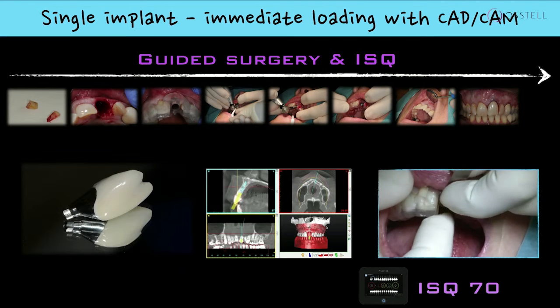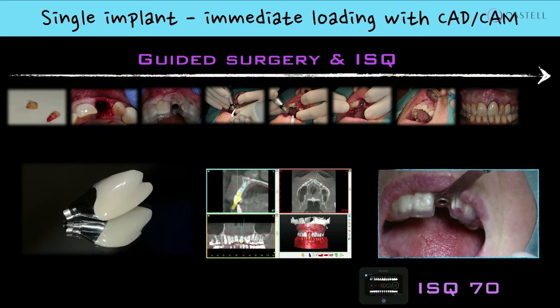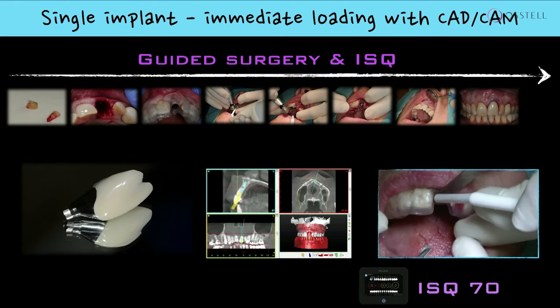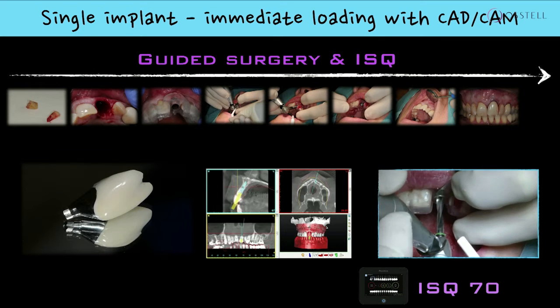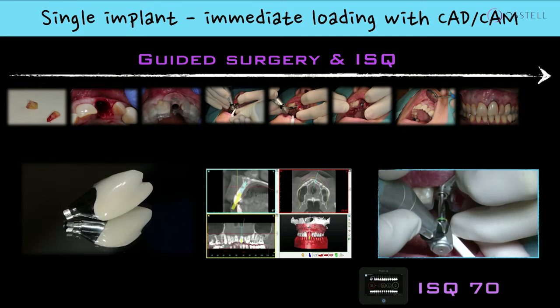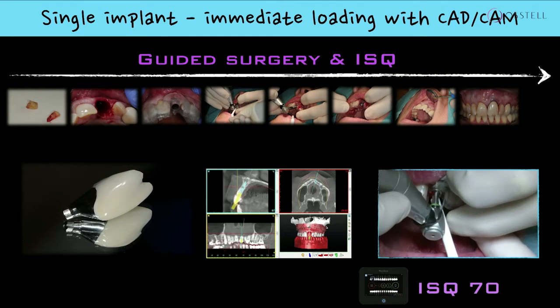So of course at that stage, what are we doing? We're drilling through a guide. Now, the problem — in quotes — with doing guided surgery is that you lose tactility. You lose the sense of when you're drilling through those types of instruments. And talking about torque, you have a squeeze fit between components, so I gain prosthetic values and I have an implant placed in a perfect angulation and position, but I have no real sense of primary stability or torque when I install the implant.